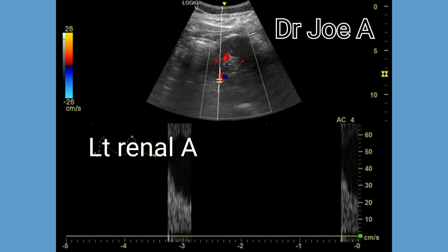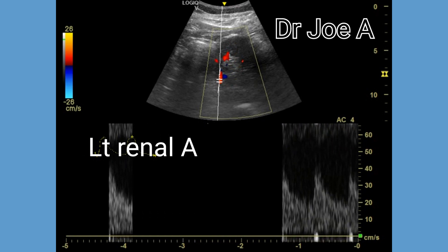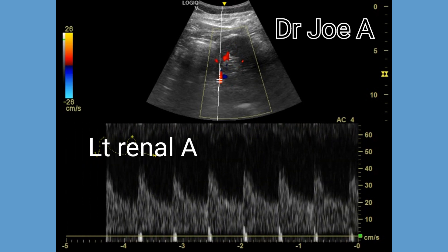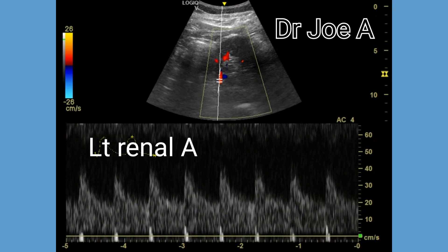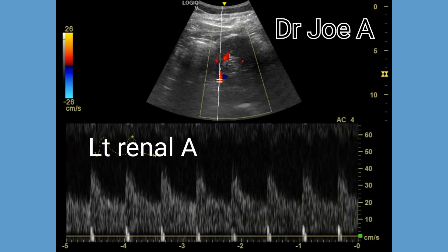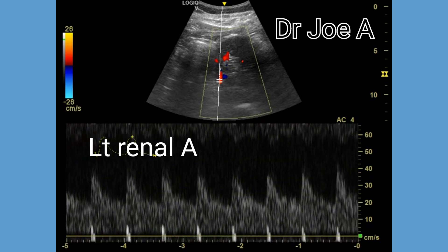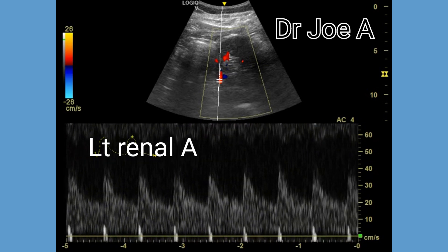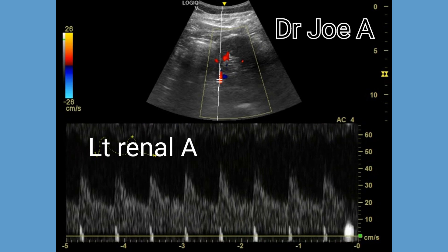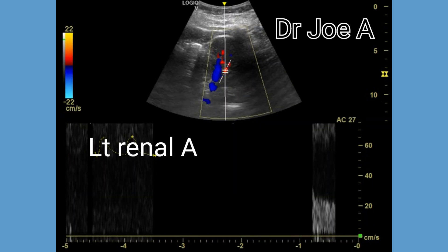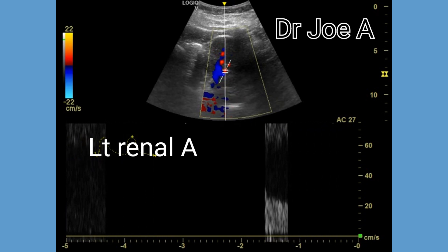Having seen the right renal artery, we now move over to the left renal artery. The left renal artery also shows a normal spectral Doppler waveform. The PSV is around the same as the right side — less than 180 centimeters per second.